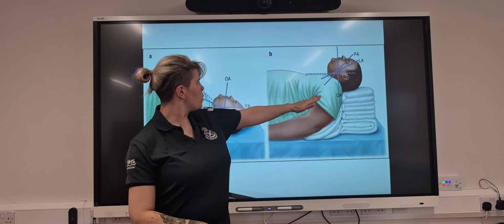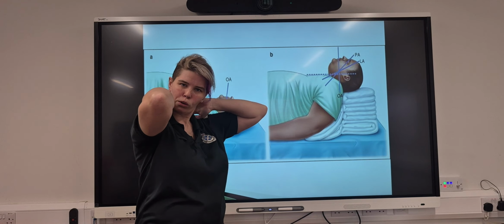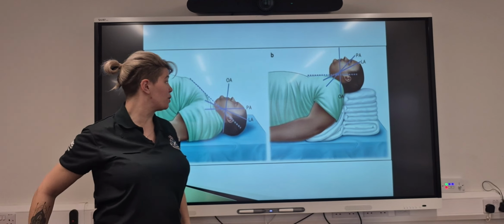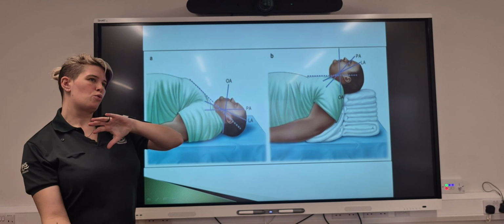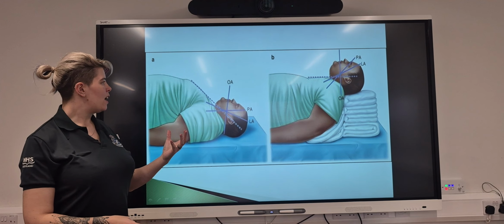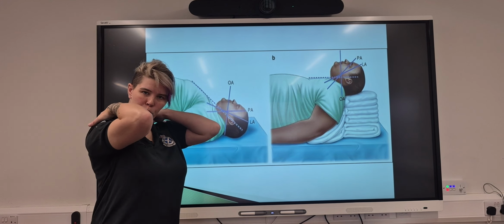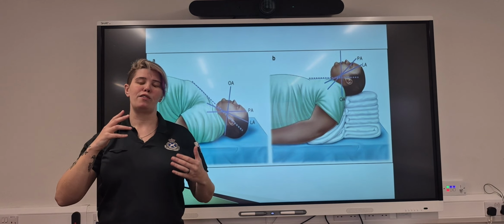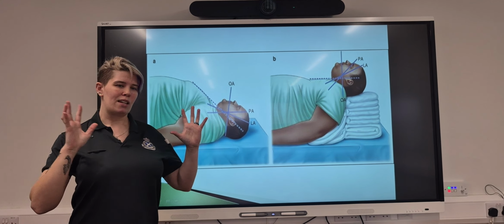So what we'll do in surgical units or even out in the field is we'll seek to prop the head and the shoulders up so we can get a better look, and so we can actually have a chance of seeing the vocal cords for putting a tube in. For you guys, obviously you're not so concerned about seeing the anatomy or landmarks. However, it may make life easier for you to consider just propping up the shoulders with a blanket, or propping up the back of the head if you're struggling to get good ventilations with your BVM. Just as I say, take it into consideration.